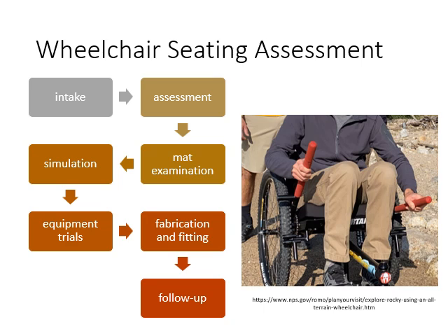The patient will be transferred onto the mat and likely will undergo several types of assessments, for example, static and dynamic sitting balance. The therapist will assess their hand function, grip strength, and their cognitive ability as well, to see whether they can learn new skills to operate a new piece of equipment.